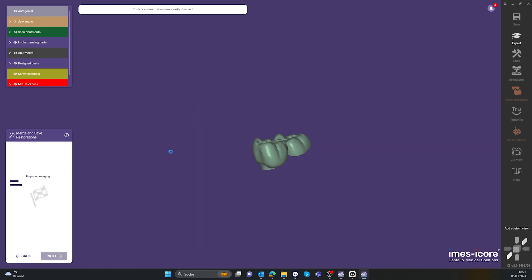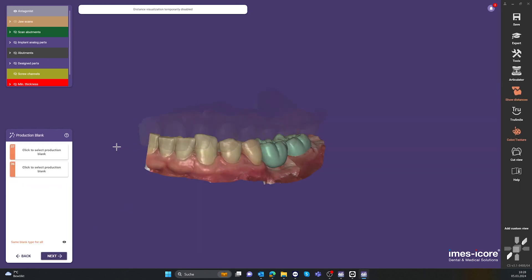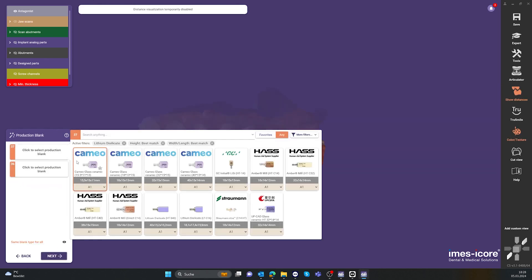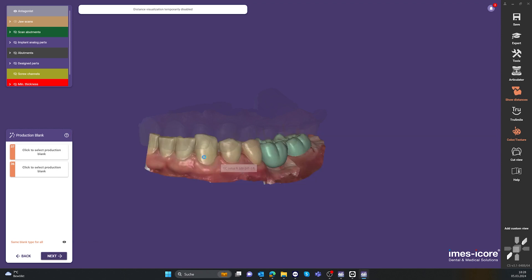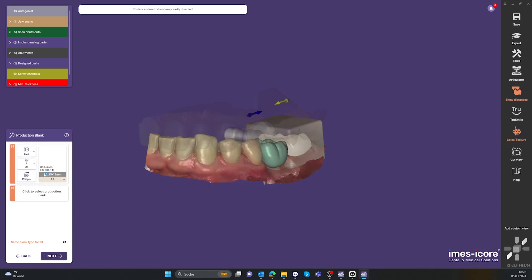We also determine the holder type — a 6-fold holder or a 1-fold holder — and the position in holder 1 to 6.